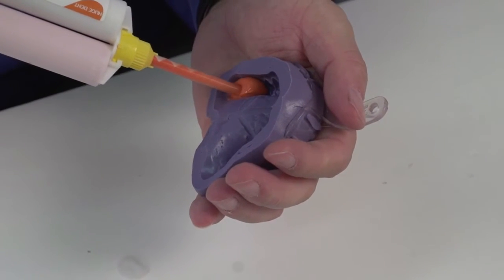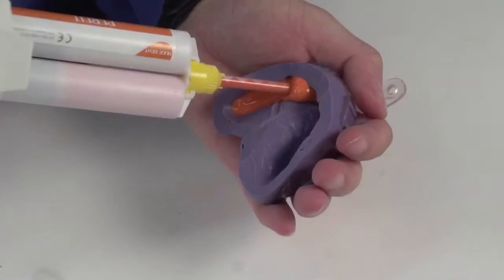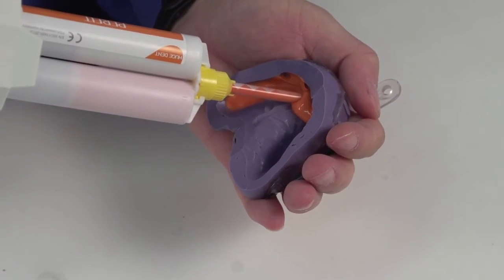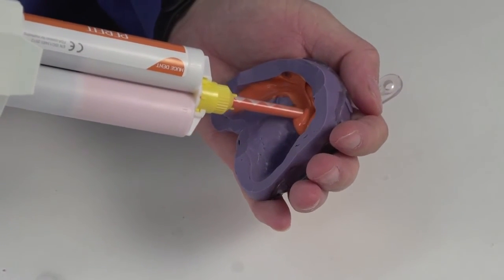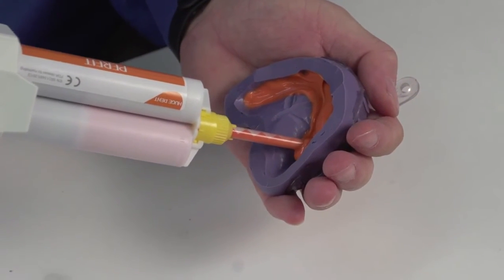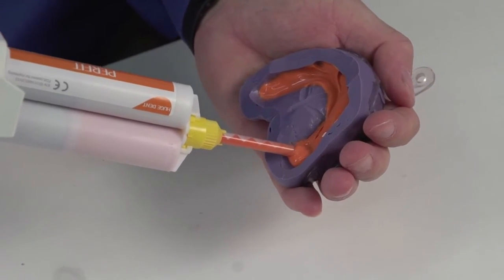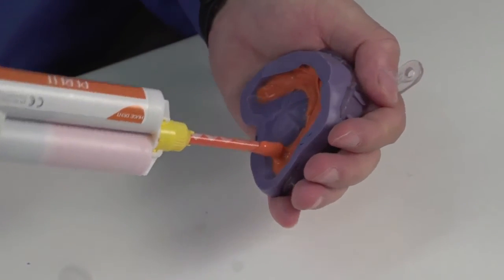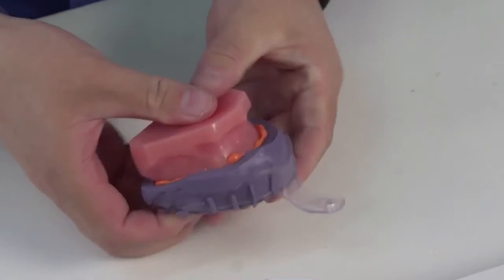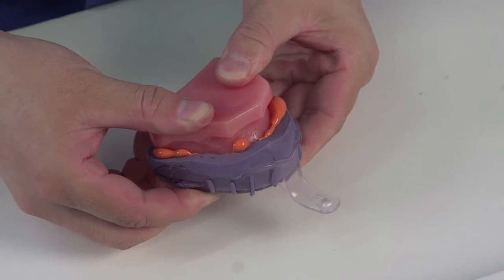Inject Perfit light body onto the tray while ensuring the mixing tip is touching the blue putty to avoid trapping air. Incorrect usage can cause bubbles. Then, inject light body onto the patient's teeth. While injecting, capture the gum line and make sure that the mixing tip is always kept immersed in the material. Put the tray with light body into the patient's mouth, slowly and accurately placing it into position in one step.